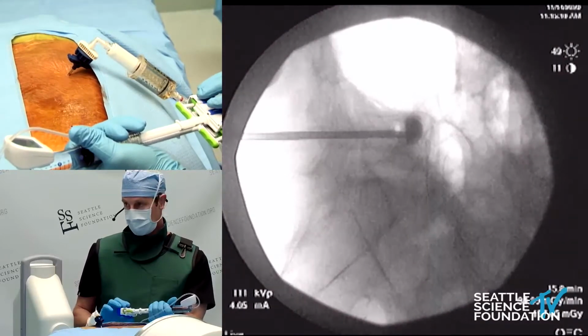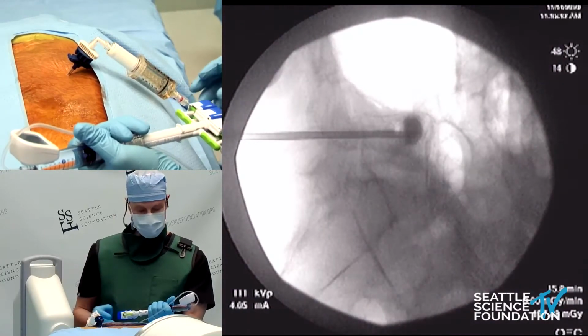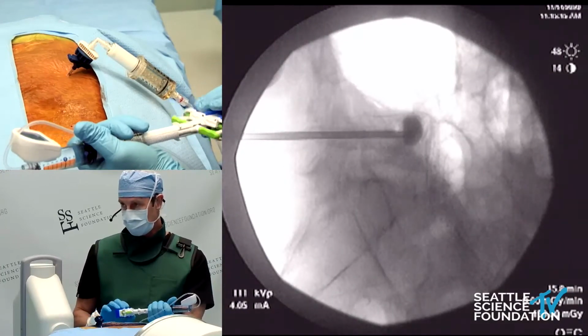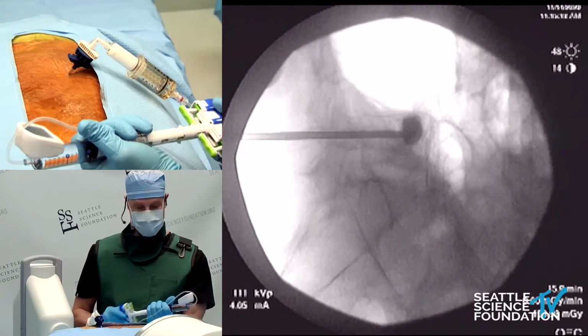Got a little bit of residual contrast in there. That's okay. We will be able to tell that from the cement. And we will start injecting.